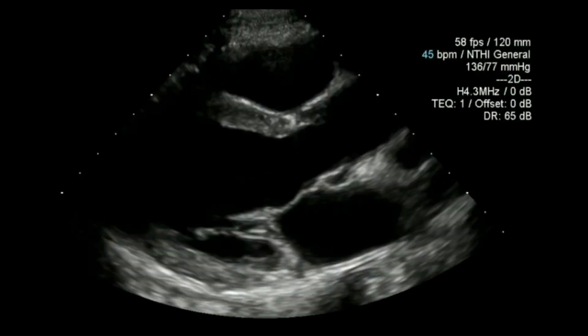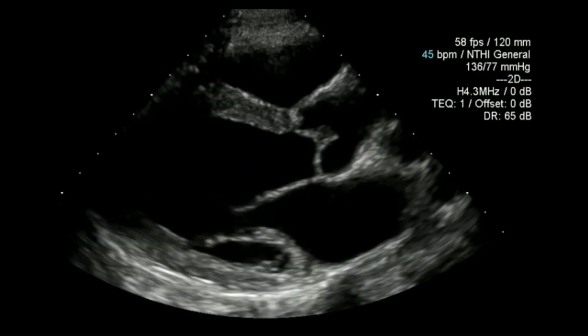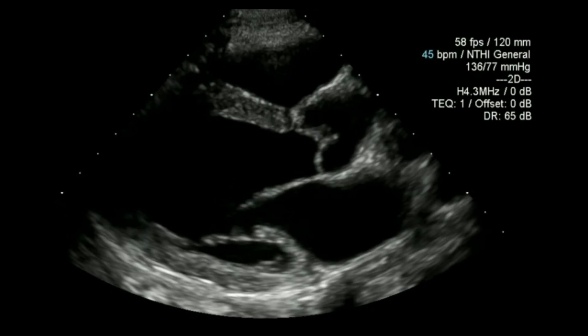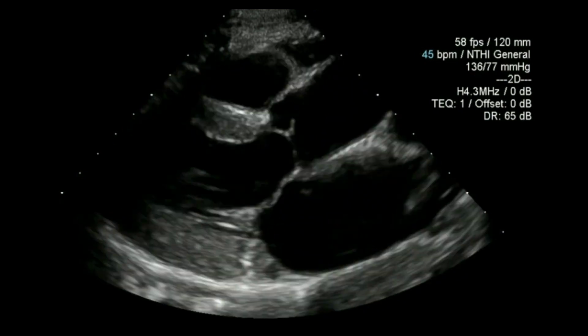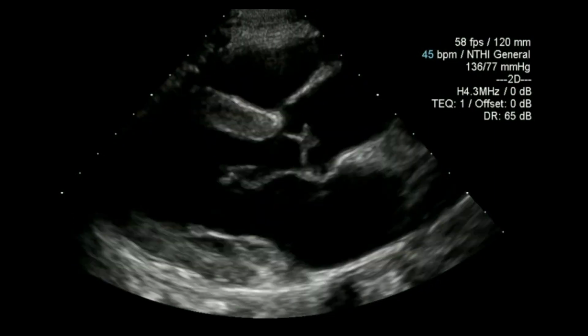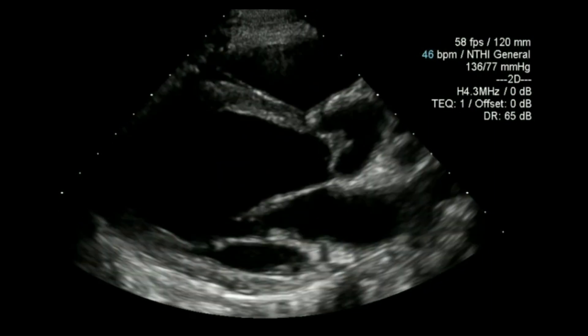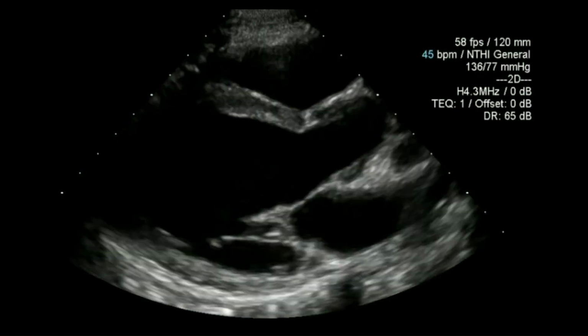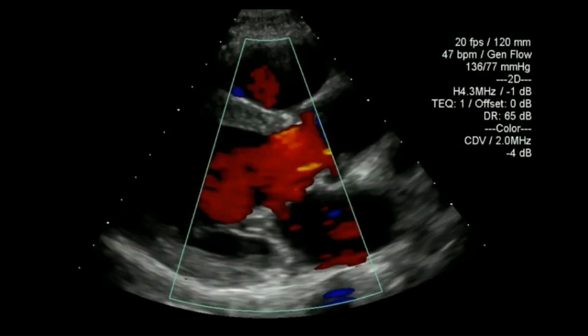Moving on to the patient with a quadricuspid valve, initially I'll show some standard transthoracic images, but also show some TOE images of this same valve. When we look at the parasternal long axis, the aortic valve morphology does look a little bit strange. The leaflet tips do seem a little bit curious when you actually do look at it there.